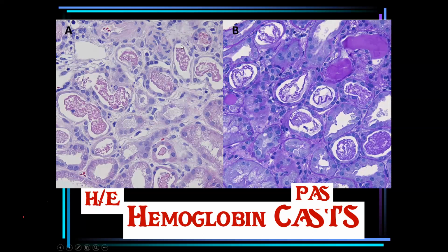As we see here, some of the renal tubular epithelial cells are shed from their basement membrane. Also here, there is vacuolization. So this is a scenario of acute tubular injury necrosis together with the formation of renal tubular cast. And the same condition, but under a different stain with PAS, the cast is characteristically formed of many small granules. But till now, this light microscopic appearance cannot tell if it is a hemoglobin cast or myoglobin cast or bile cast or whatever cast.